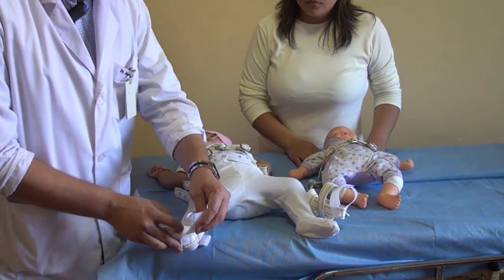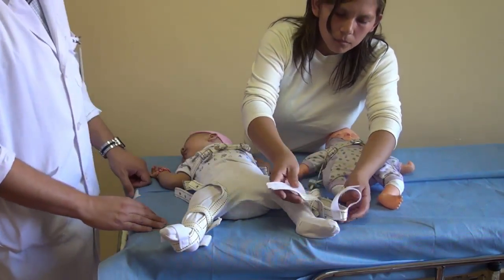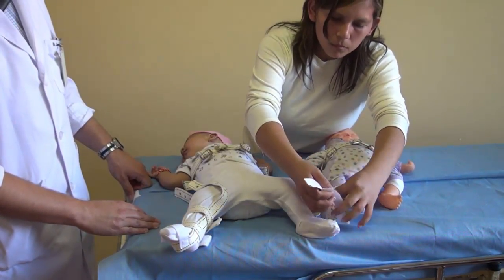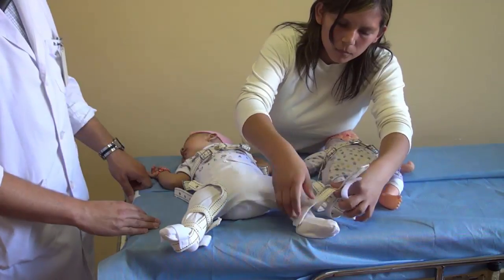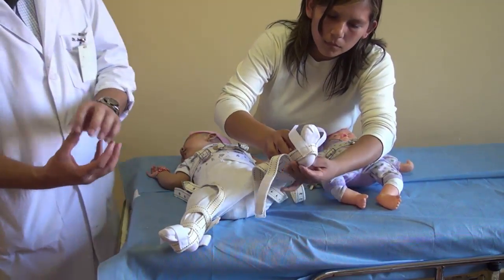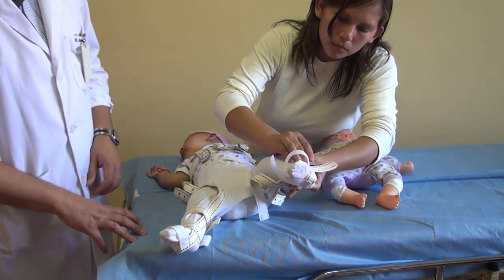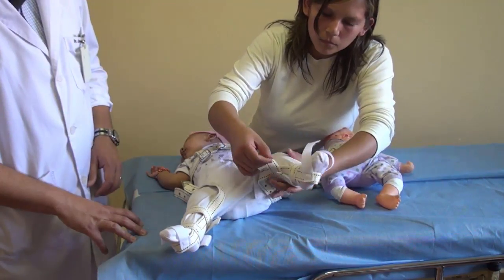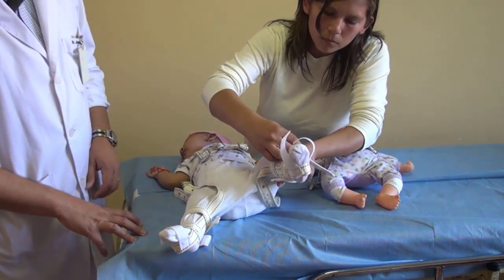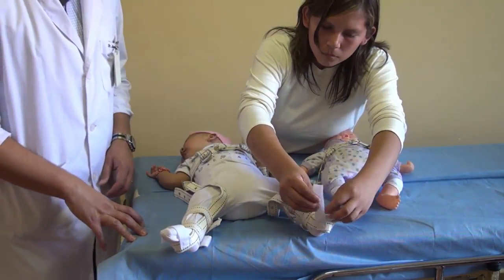Now we tell the mother to do the other side. She opens it, fits the hind foot snugly — the lower one, the upper one, and then the foot.